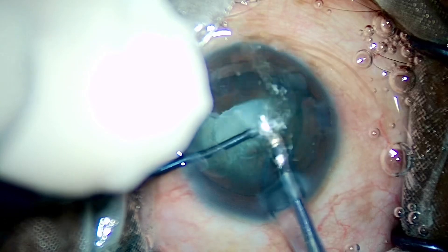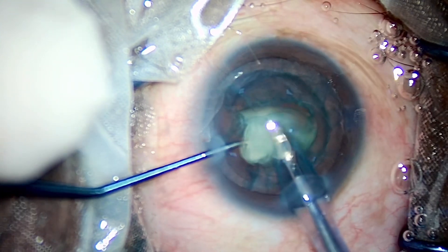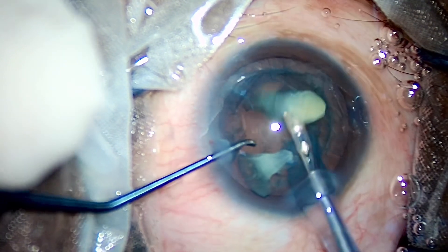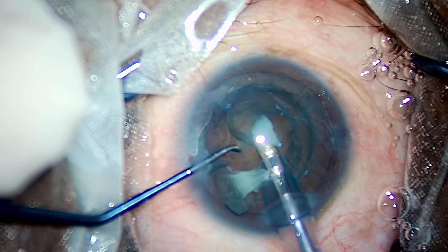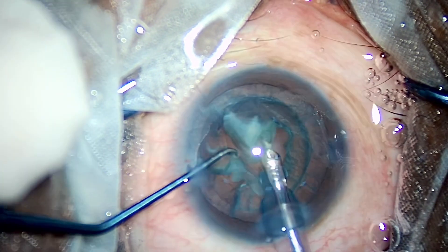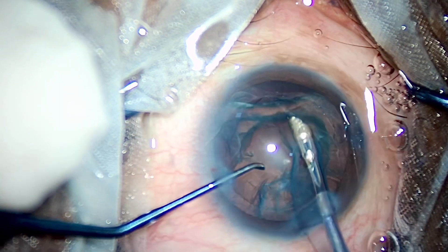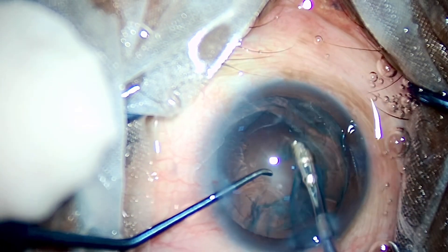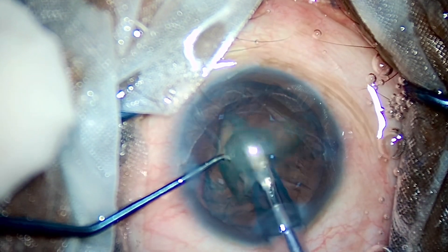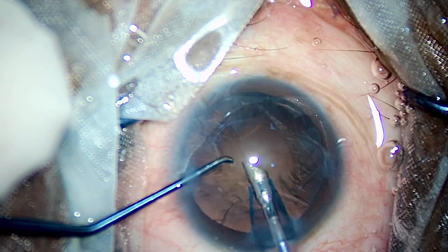Keep a close watch on the posterior capsule. You need to tell me what happened, where it happened, and how it happened. You will win the title of Sherlock Holmes from my side. Just aspirating the epinucleus — and that's it. Boom, the case is almost complete.